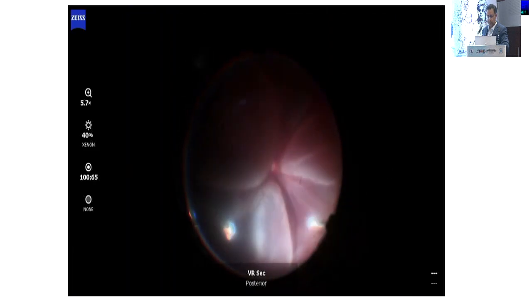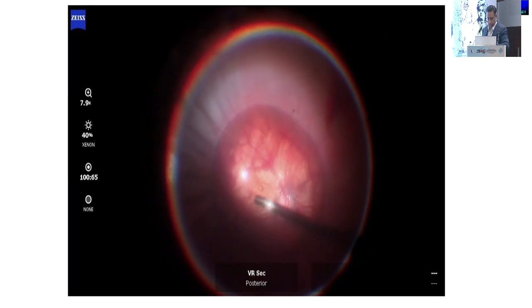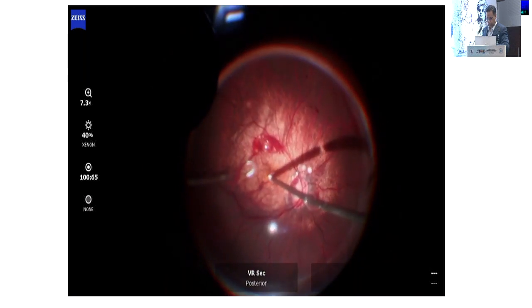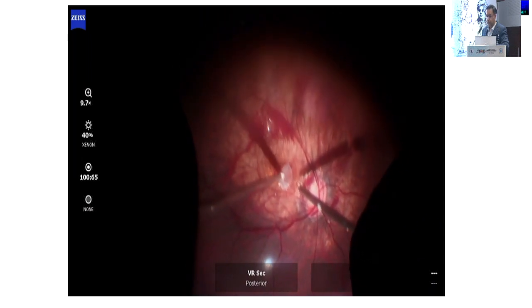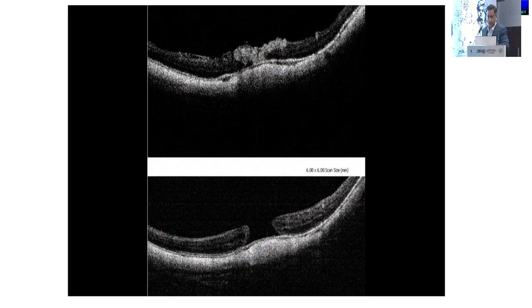This was a failed macular hole case who developed a total retinal detachment with vitreous hemorrhage. In such cases, we place the graft under PFO or after fluid air exchange. You can see how we bimanually slide and spread the graft and place it accurately under PFO. Post-operative OCT shows that the retina is attached and the macular hole is closed.